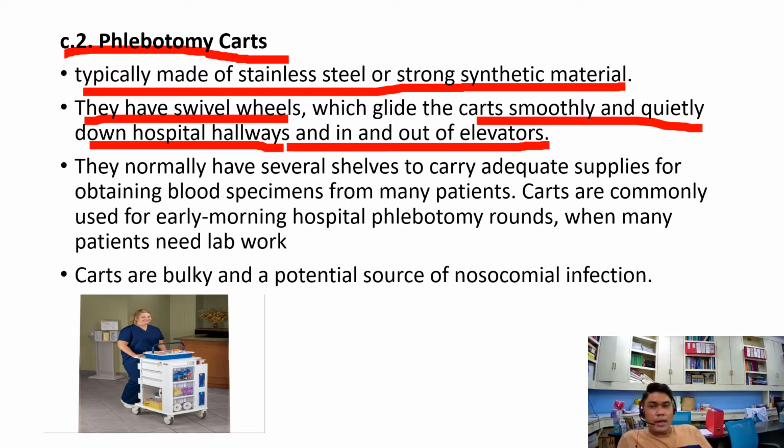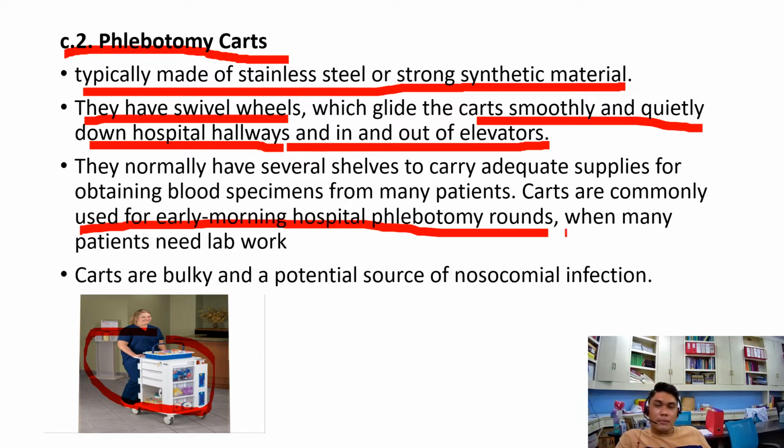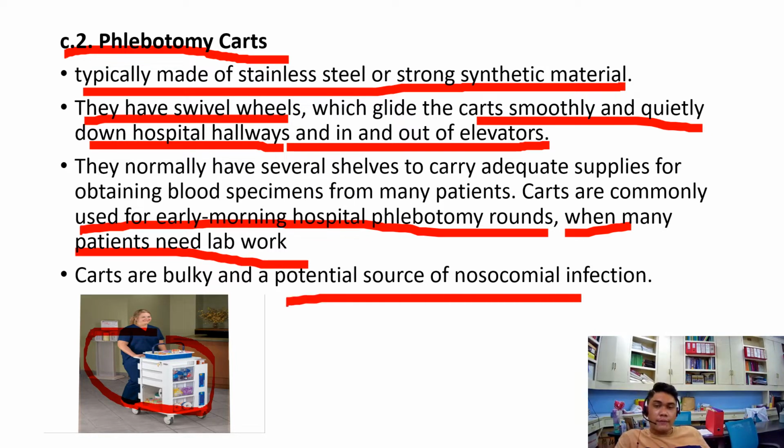Then they normally have several shelves to carry adequate supplies for obtaining blood specimens from many patients. And carts are commonly used for early morning hospital phlebotomy rounds when many patients need lab work. Okay, so carts are bulky and a potential source of nosocomial infection.